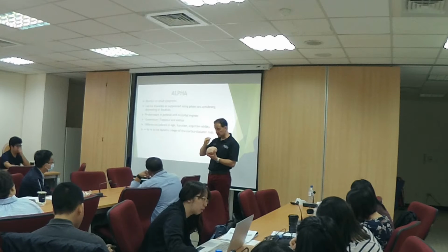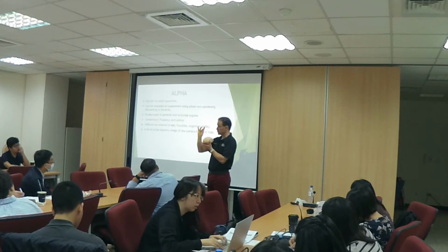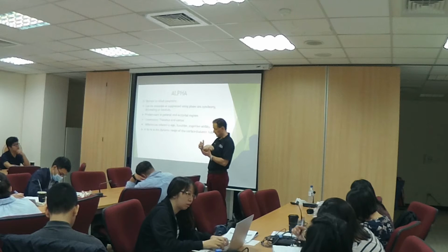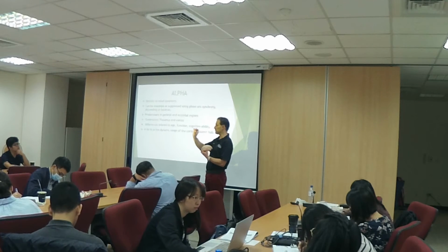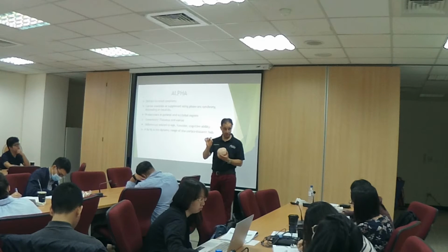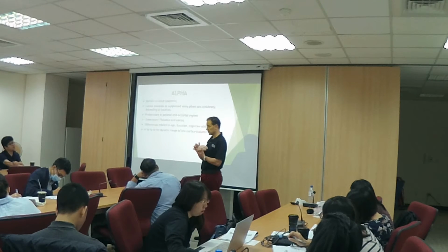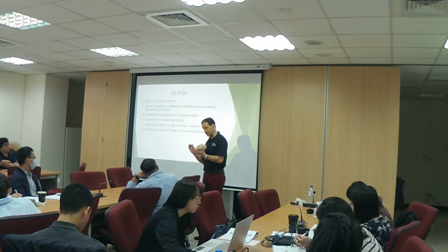When you close your eyes, alpha gets bigger back here. When you open your eyes, it's supposed to suppress. So if the person opens their eyes and the alpha is still big, we have a problem. All right? And we want a basic background alpha rhythm back here to achieve self-regulation. So if you're looking at the eyes open EEG and the person doesn't have a lot of alpha at PZ, it means they're not being able to self-regulate.